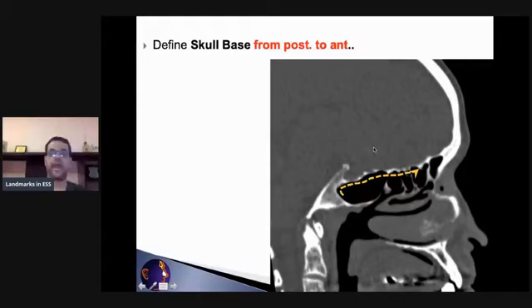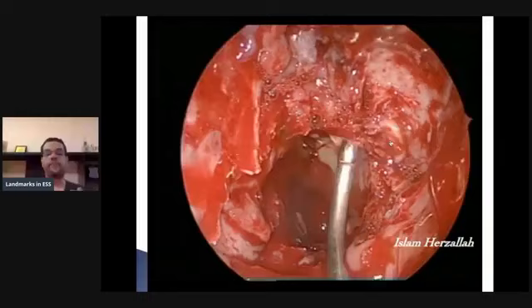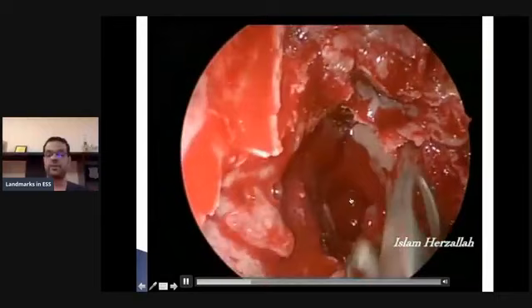As you enter the anterior ethmoid, posterior ethmoid, and sphenoid sinus, you now have a much easier way to go from posterior to anterior along the skull base and clear this. Let me show you. So now I enter the sphenoid sinus. The anterior and posterior ethmoids are partially clear, not fully clear. So I'm now going to clear the cells on the skull base, starting from the sphenoid sinus posteriorly and going anteriorly over the posterior ethmoid and then the anterior ethmoid.